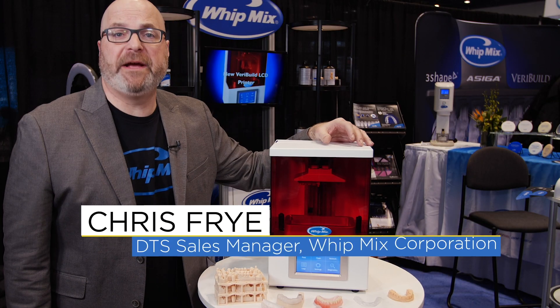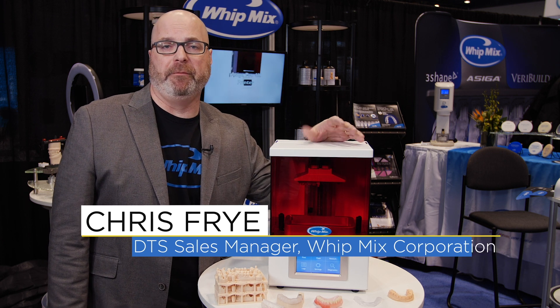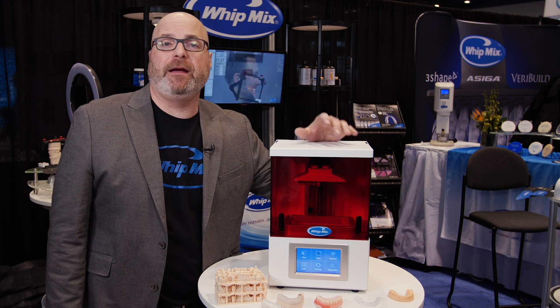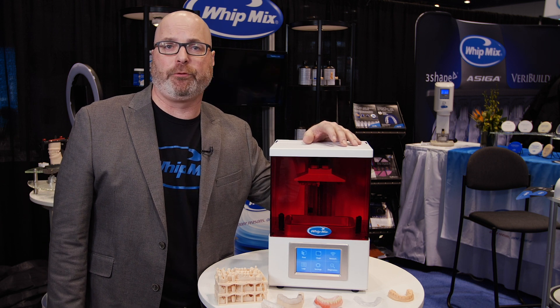Hello, I'm Chris Frye with Whip Mix Corporation and we're here at the 2020 Chicago Dental Society's Midwinter Meeting. Whip Mix is very proud to be launching our new VeriBuild LCD 3D printer.